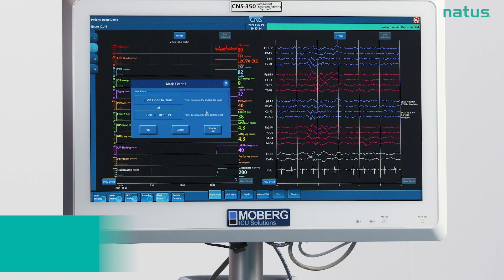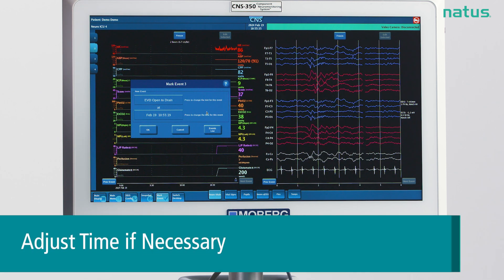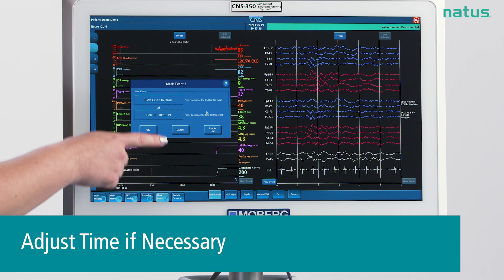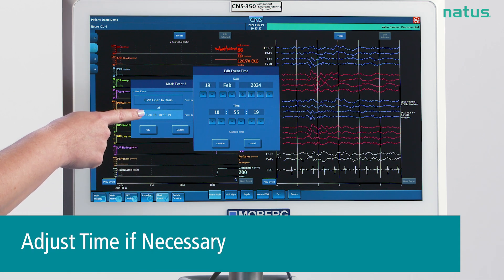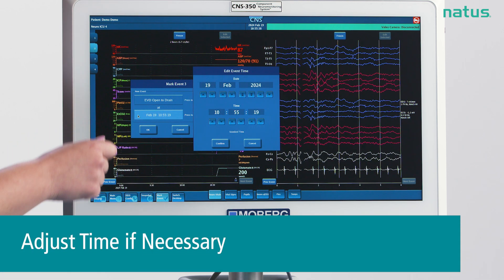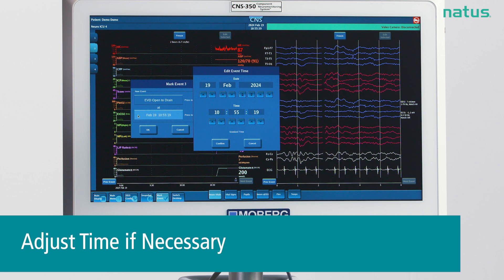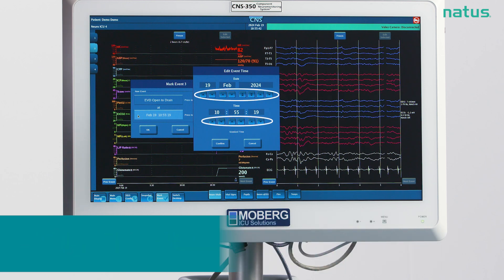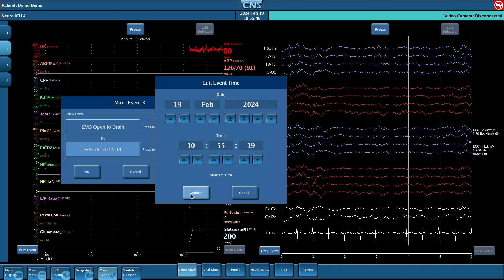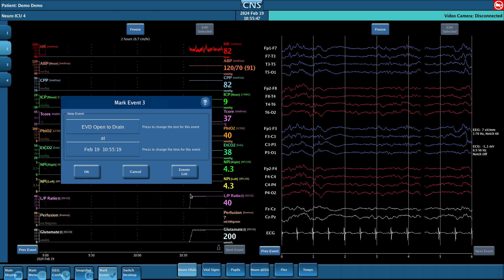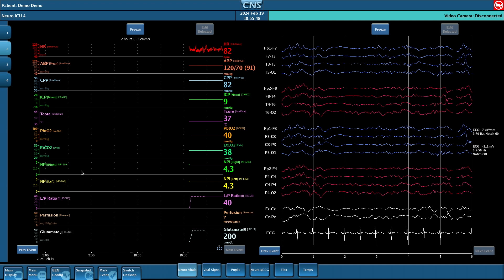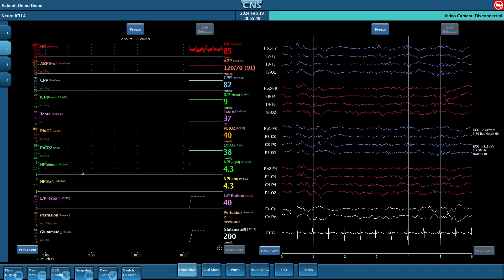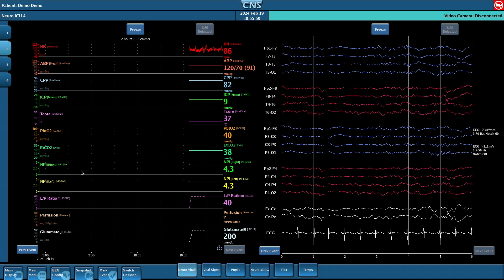If you need to change the time that the event happened, you can do this by tapping on the date and time and adjusting the up and down arrows. Then hit confirm and OK. And the event is marked in the data.